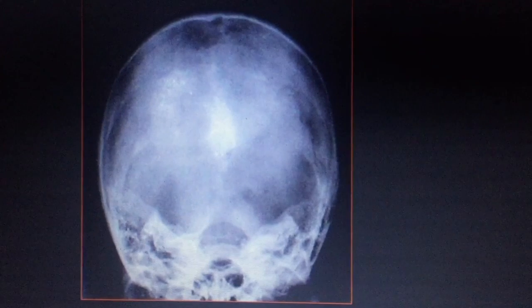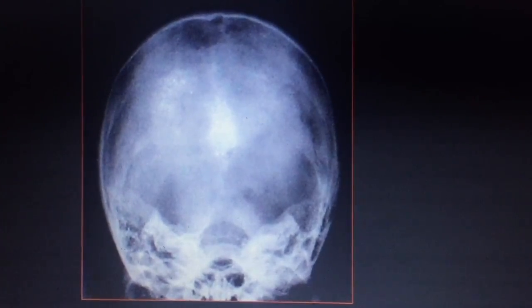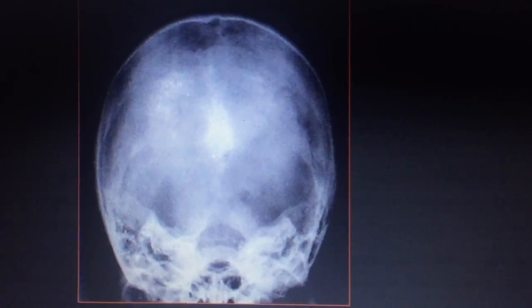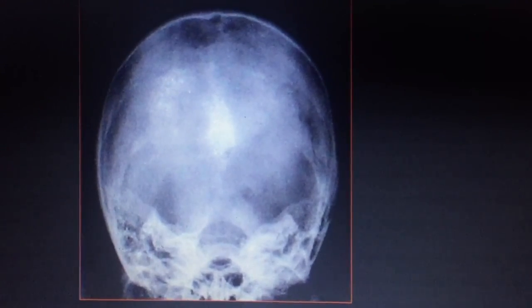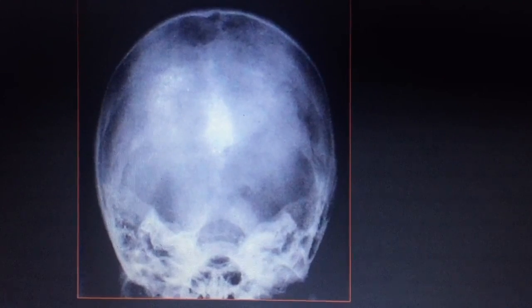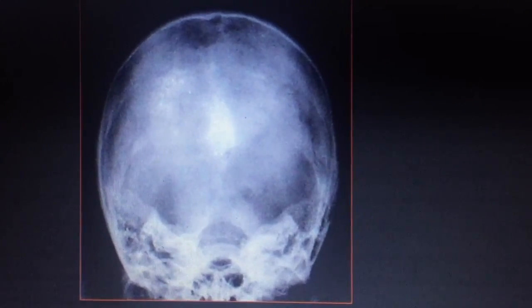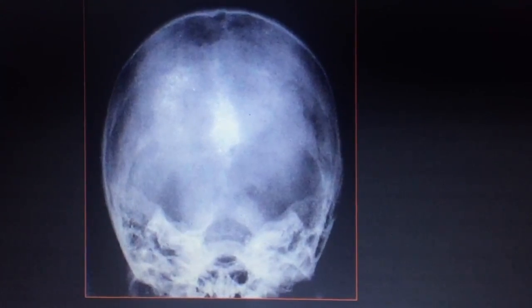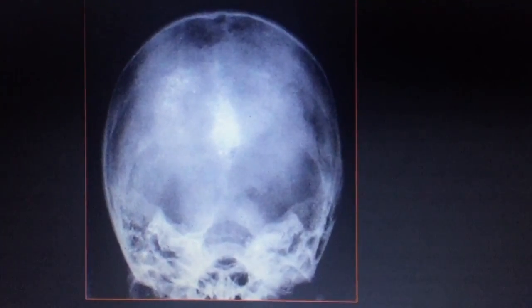So now the next image that I will critique is the AP axial skull Towne method. When evaluating this image, also look for evidence of proper collimation, making sure that there is equal distance from the lateral border of the skull to the lateral margin of the foramen magnum on both sides, indicating no rotation.